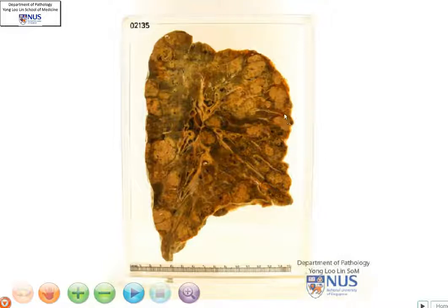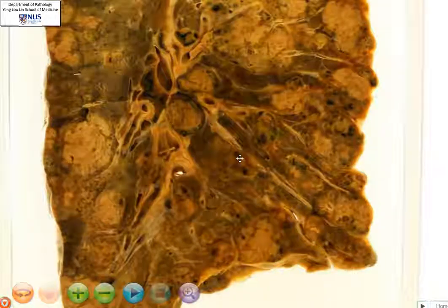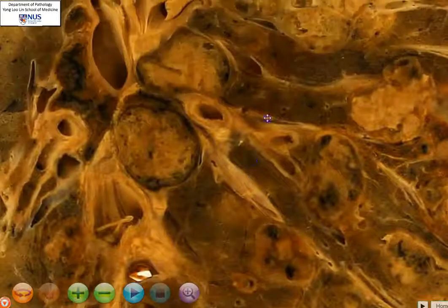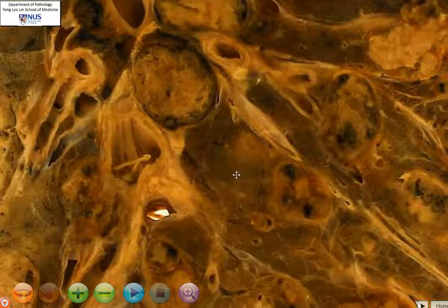...that there are multiple masses which are irregular and fairly well-demarcated, dotted throughout the lung parenchyma. If we zoom in, we can actually see that there is normal lung parenchyma in between the masses.